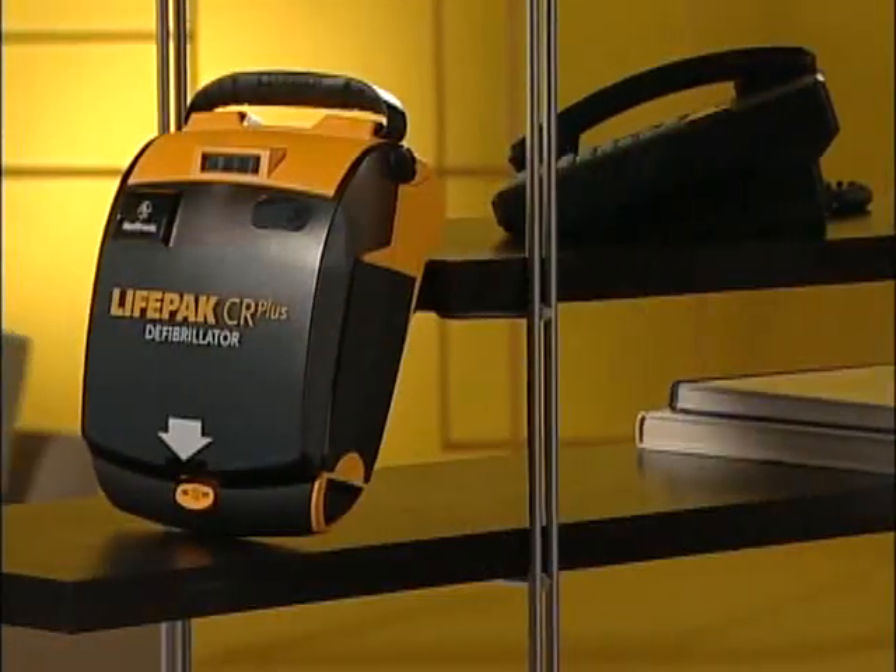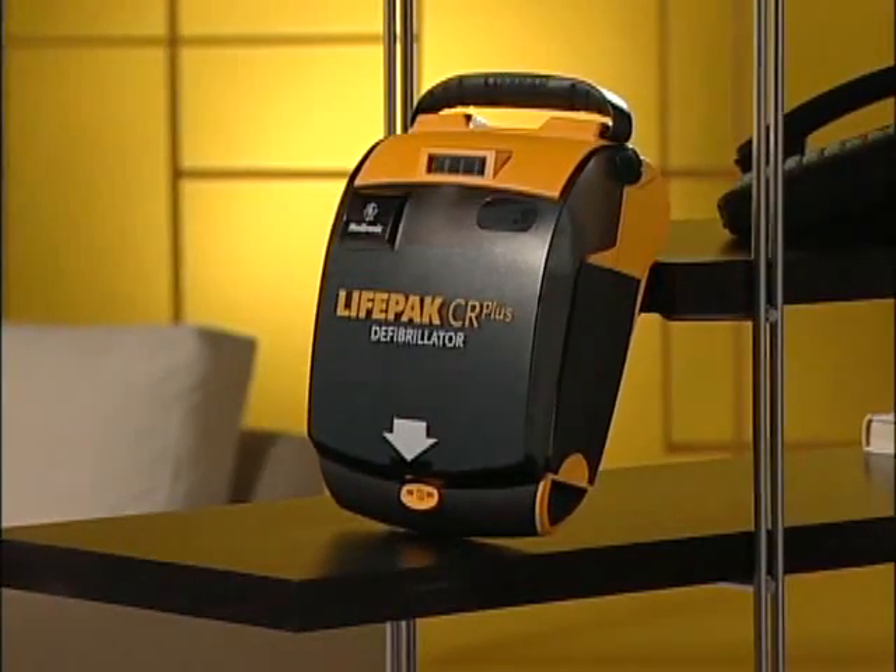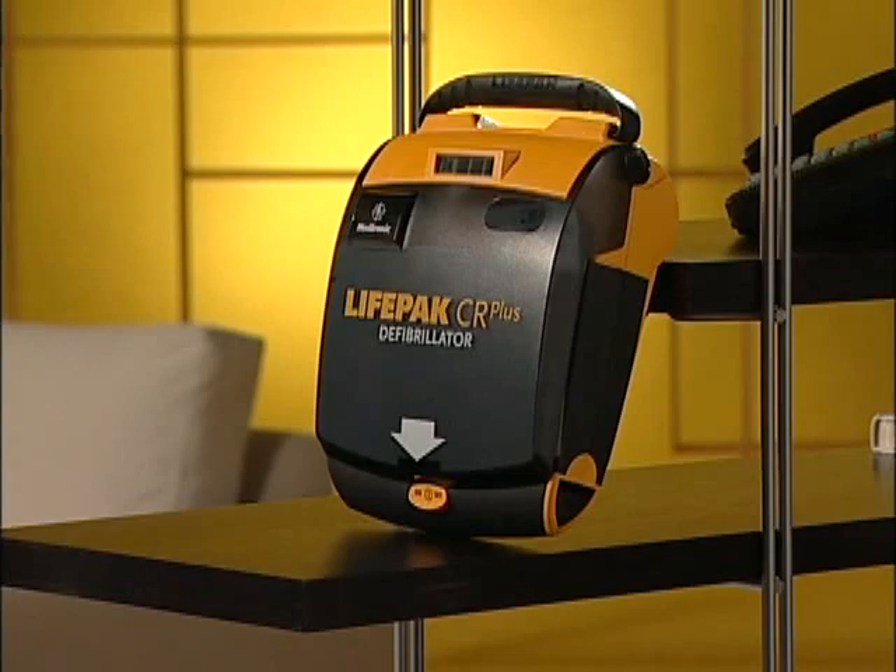Finally, where to store the LifePak AED. You should keep it in a central location, preferably near a phone so you can call 911 while you're getting the AED. Put it somewhere that's easy to see and easy to grab in an emergency. Make sure everyone knows where it is, and if you take it out, be sure to put it back in the same place.